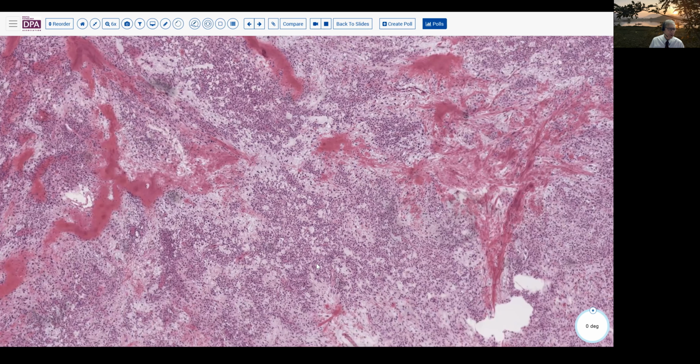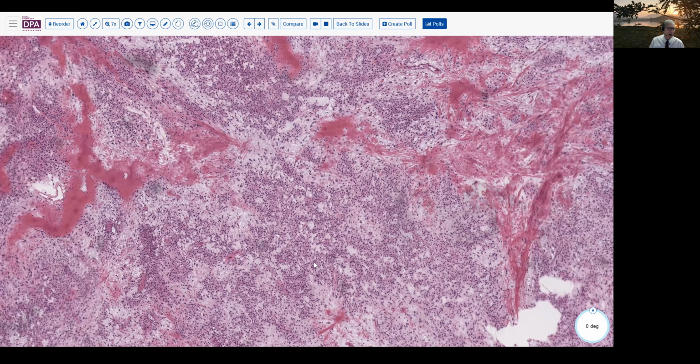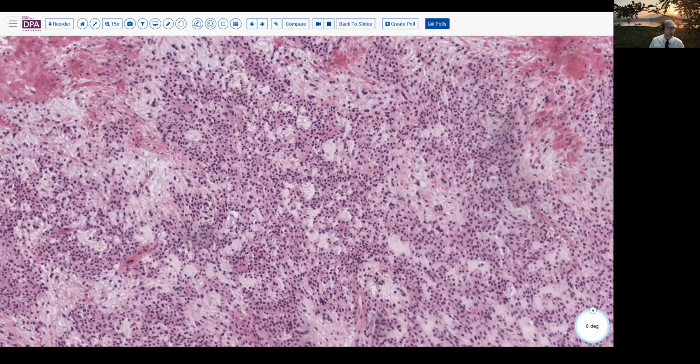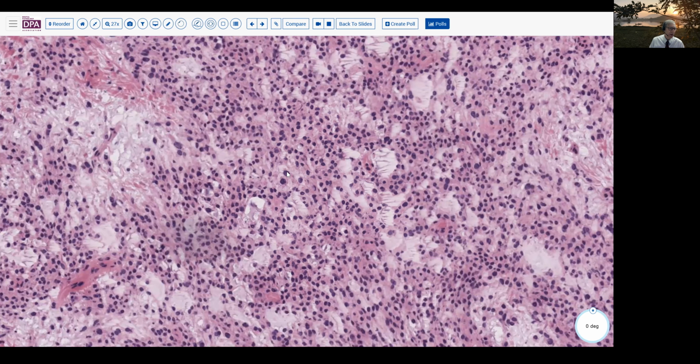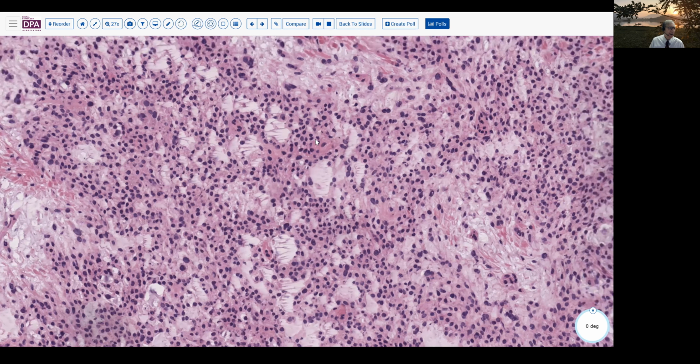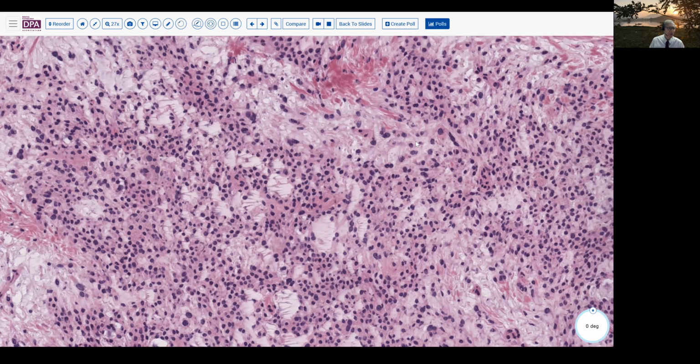There's no necrosis in this tumor. And on higher magnification, we see these quite compelling small cystic spaces, fairly bland intervening nuclei, a slight degree of pleomorphism to some of these cells. But we could identify absolutely no mitotic activity despite a rather lengthy search during the time of frozen section.